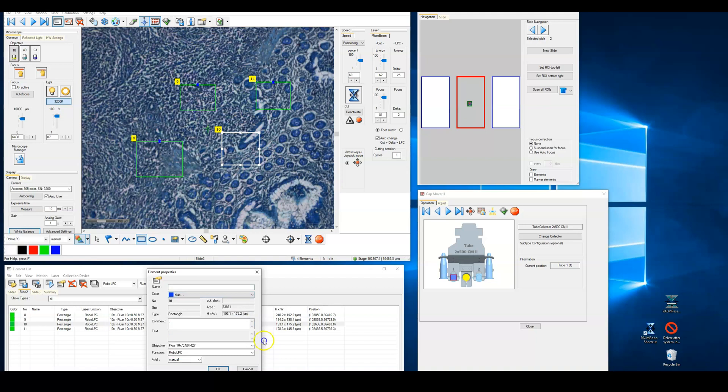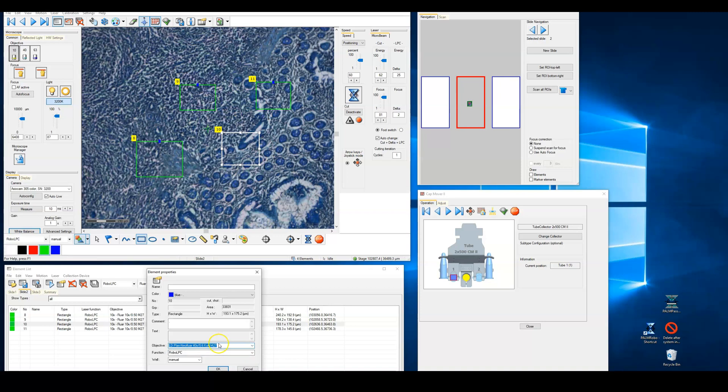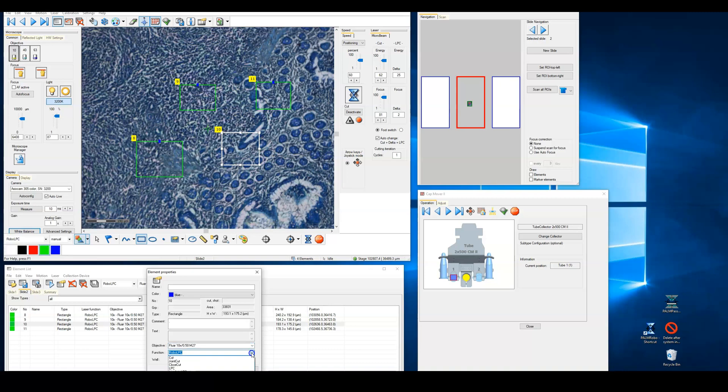Finally, the elements can be directed to different capture devices. By default, this is set to manual, and the capture device in place is used. But individual elements can be specified for different capture tubes, and the capture device will move appropriately when the tissue isolation is taking place.